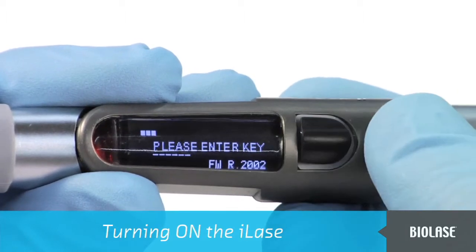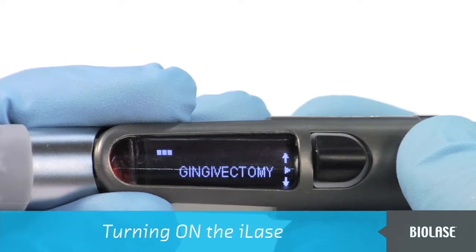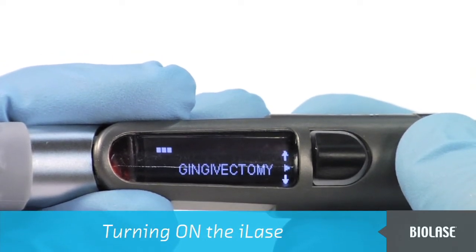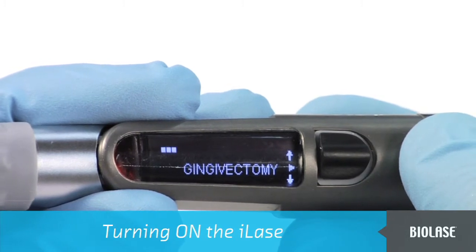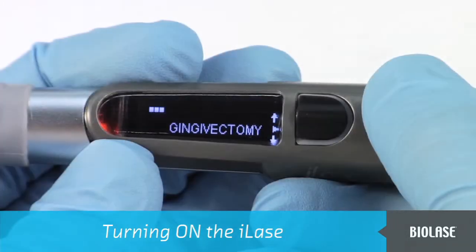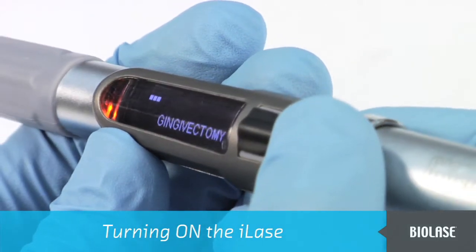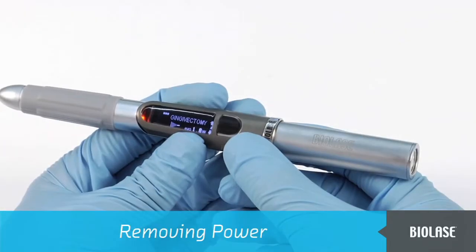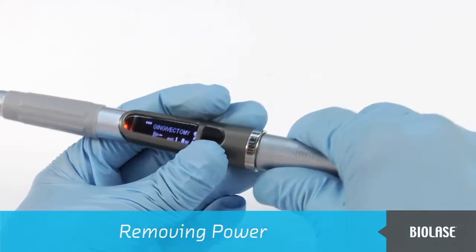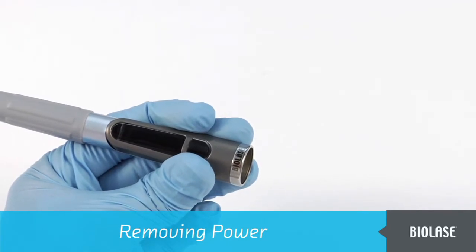When you see the screen asking you to enter a key, press in the black navigation button twice, quickly. After successfully entering the key, the iLase will ask you to select a procedure, which will be explained shortly. Also note that the LED is orange, meaning that the iLase is in standby mode and the laser cannot be activated yet. To remove power from the iLase, simply pull the battery out. This also serves as an emergency stop function.